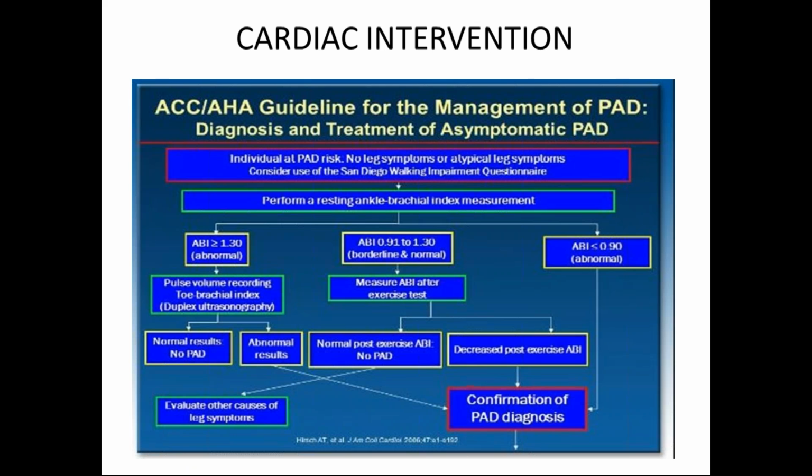All right, so we do all of this. How do we manage these patients? What should we do when these patients come with varying abnormality? So the American College of Cardiology and the American Heart Association guideline for the management of PAD, using the pulse volume recording ABI.